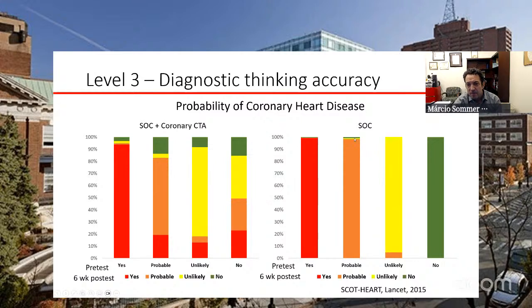There's a minimal change in both directions of the probable, and there's a minimal change from the unlikely, or maybe because the stress test came positive, they're now probable. But minimal change within the intermediate or the unclear diagnosis, and not much change. So it didn't add anything to what the clinicians were thinking. You look on the other side, this is quite impressive. On the people you said, this is not angina, and then you turn your impression, 25% of the patients flat out say, no, this is angina now. I really think it is.